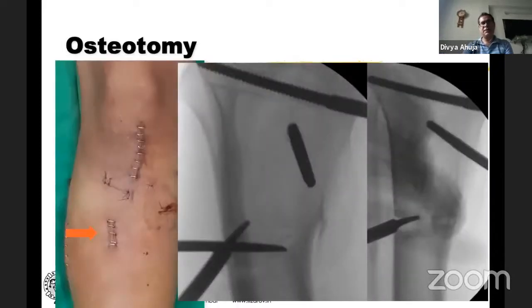The left image shows a post-op image of a slightly bigger incision than the normal incision we make. Then through the drill bits, that's the osteotome going for that neutral wedge correction, directed distally and then proximally as well. This is a bone spike just to prevent soft tissue damage.